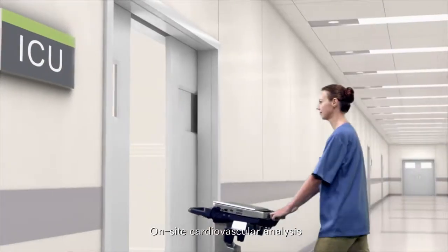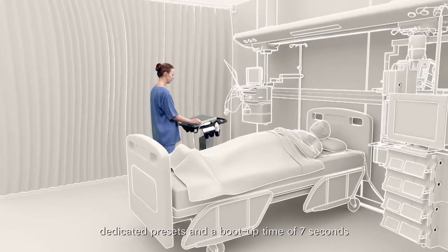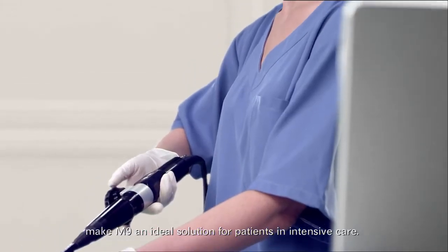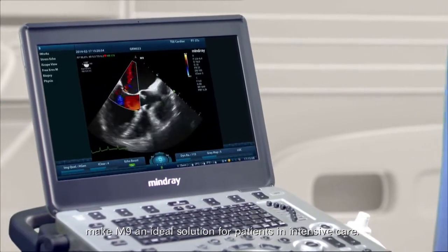On-site cardiovascular analysis, dedicated presets, and a boot-up time of 7 seconds make M9 an ideal solution for patients in intensive care.